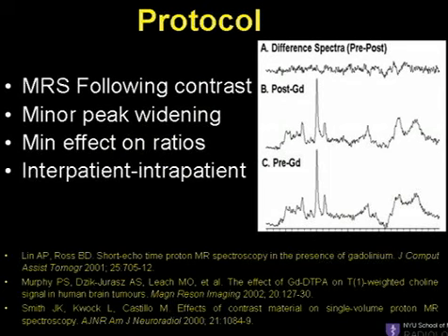Sometimes there's a question of the effect of gadolinium on MRS, and a lot of people have looked into this now, and really the changes pre and post gad on different spectra are very minimal. So we do all of our spectroscopy post gadolinium, because we don't think it really has much effect on the MRS.